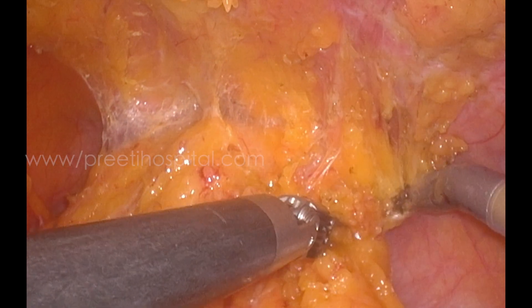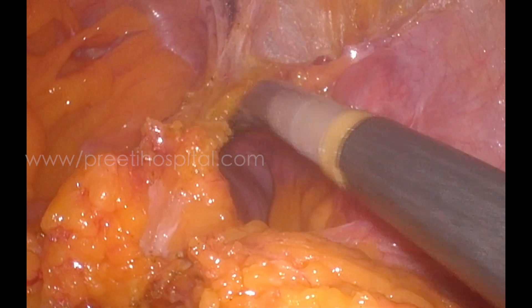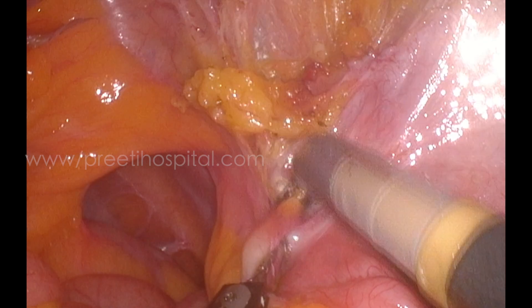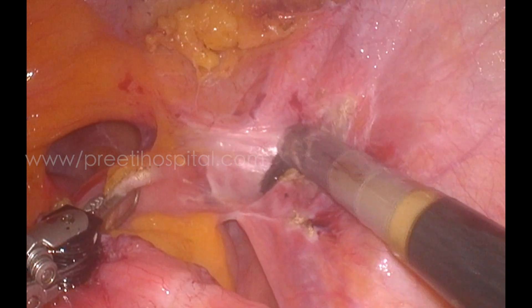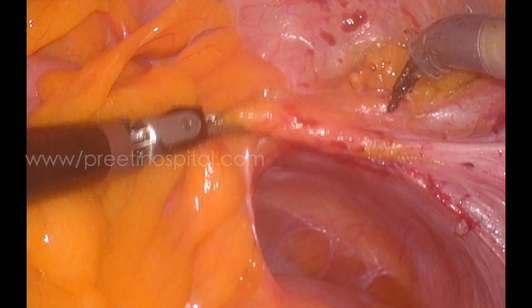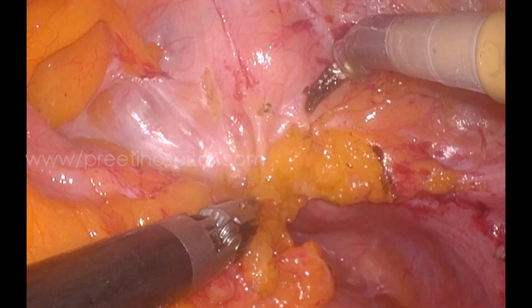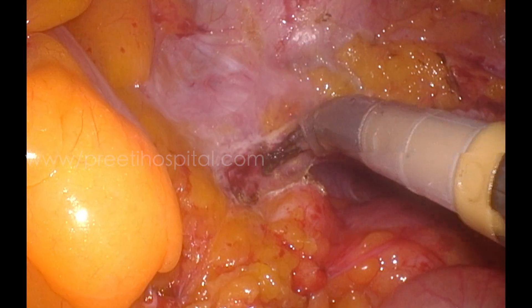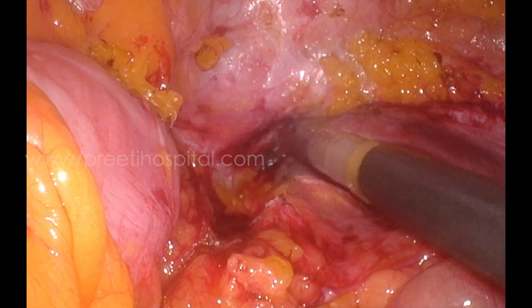The patient is in the head-down position. The ports are placed: one port above the umbilicus, and the other two ports eight to ten centimeters on either side equidistant. With the open blades of the scissors, very fine dissection is possible without injuring any surface of the intestine. I had been concerned about how difficult it would be, but it was not that difficult. We practiced around 10 hours before doing this surgery, but laparoscopic skills and surgical principles are essential for any new equipment.